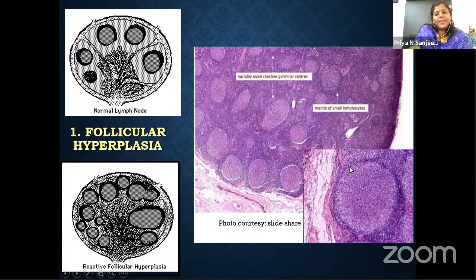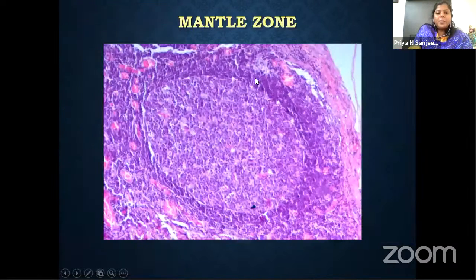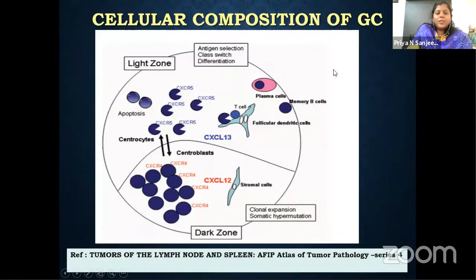How does the secondary lymphoid follicle appear? It has a pale germinal center in the center, and you have a mantle zone at the periphery. Here you can see the variable sized germinal center in a secondary lymphoid follicle with a prominent mantle zone. The mantle zone is crescent shape. It is thicker near the capsule and thinner near the medullary area. We have already learned a little bit about the germinal center.